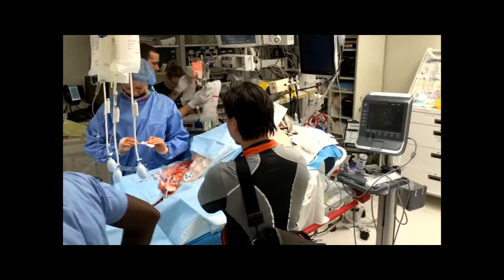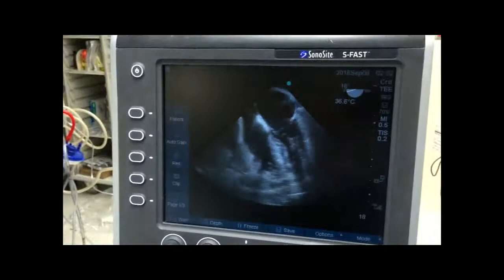Here's an example: this guy's getting a central line, he's all covered up, and we're watching his heart continuously. Because once you put the probe down you don't need to touch it—and then this happens.